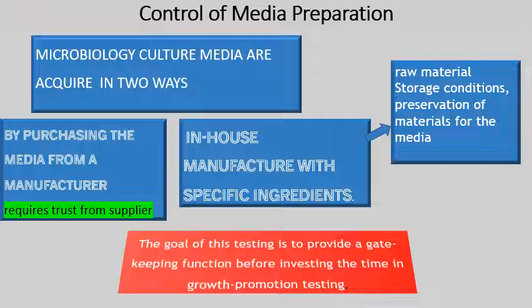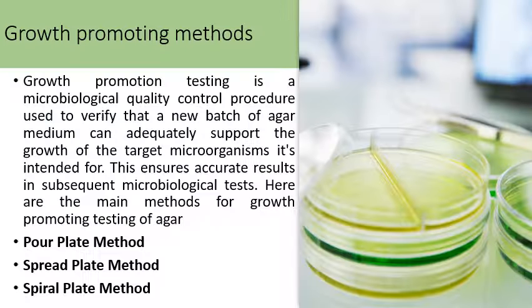So the goal of this testing is to provide a gatekeeping function before investing time in growth promotion testing. If any of this is not ensured and the growth promotion testing is carried out, the result is bound to fail, because the growth promotion testing relies on the integrity of the media. Integrity of the media relies on the integrity and quality control of whoever is preparing this media. So after this is done, then we go to what is called growth promotion testing.